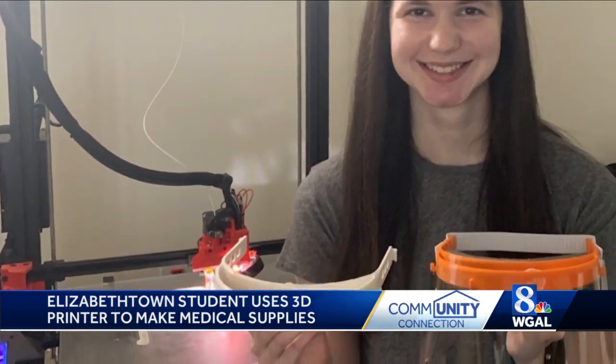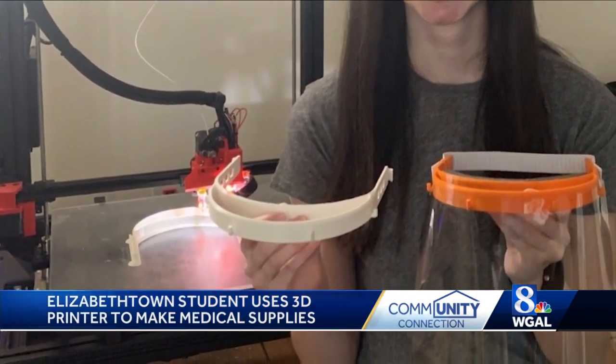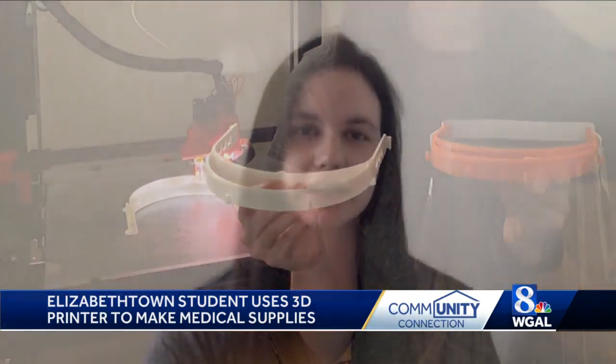How many are you able to crank out? The headbands take about four hours to print, but I just let the printer run, and then it takes about 30 minutes per face shield to make.